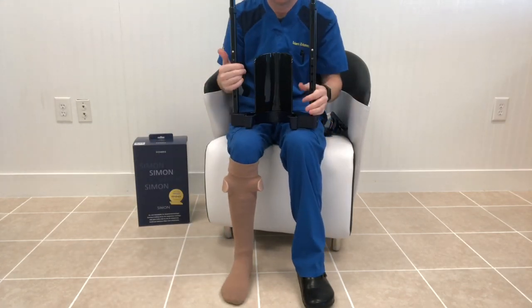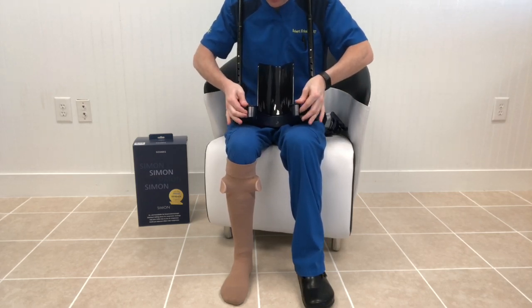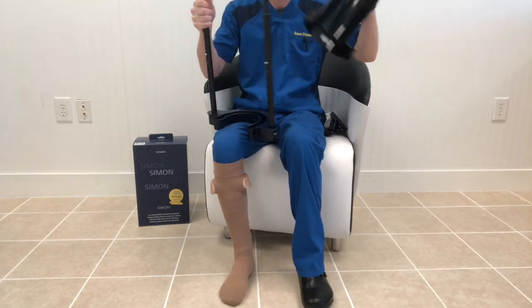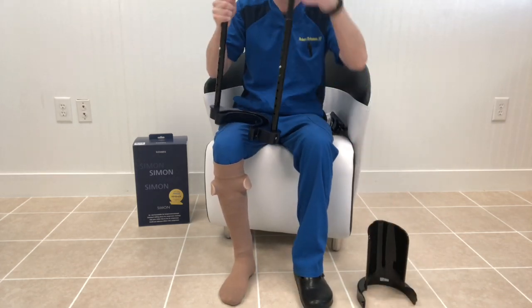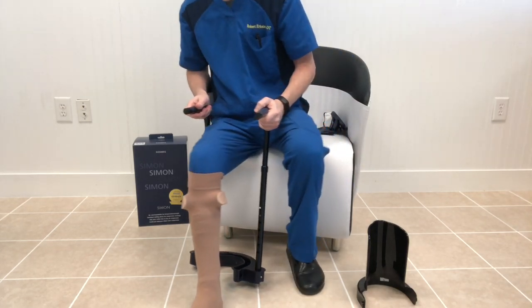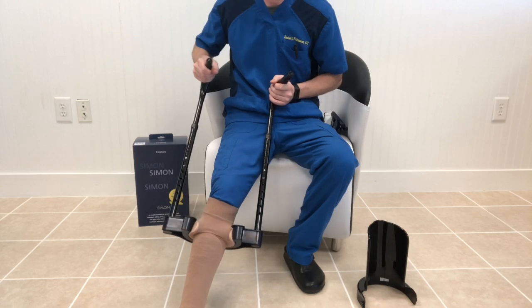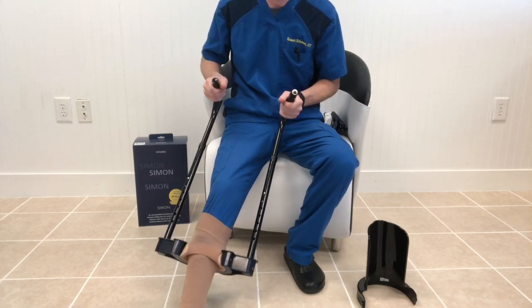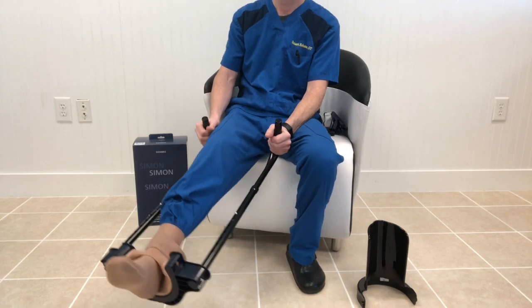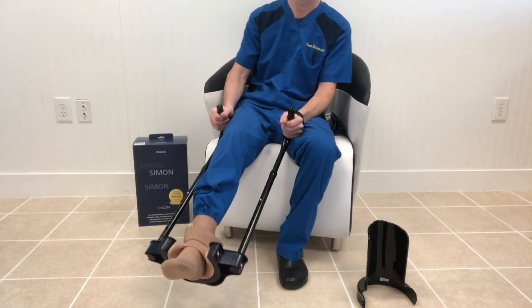You can remove the big part in the middle there by pushing those push buttons in. It's a little tricky to do, but it does make it easier in this stage. That's optional, but it gives you more freedom to move, not having that piece in the way because it's not needed for taking compression stockings off. Here it's important that you wedge the ring in completely. If it's partially in, it can rip the compression sock as the sock begins to slide out.